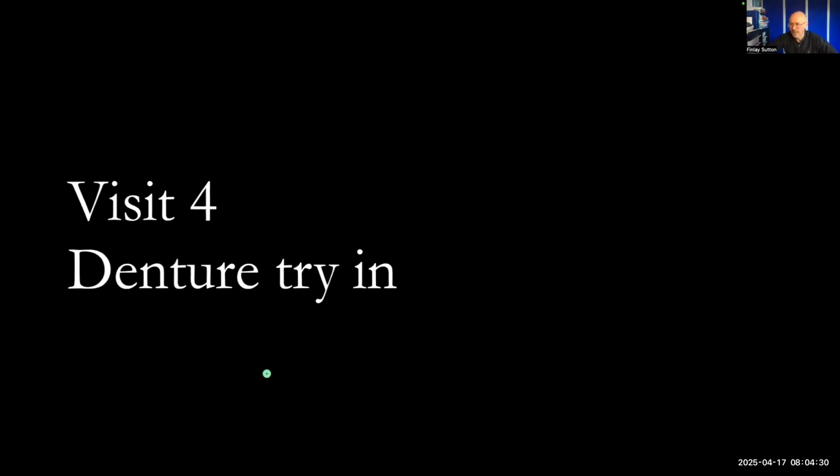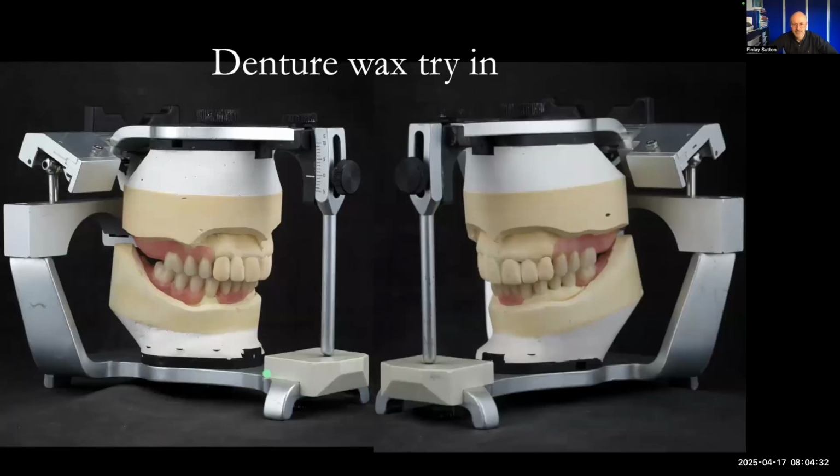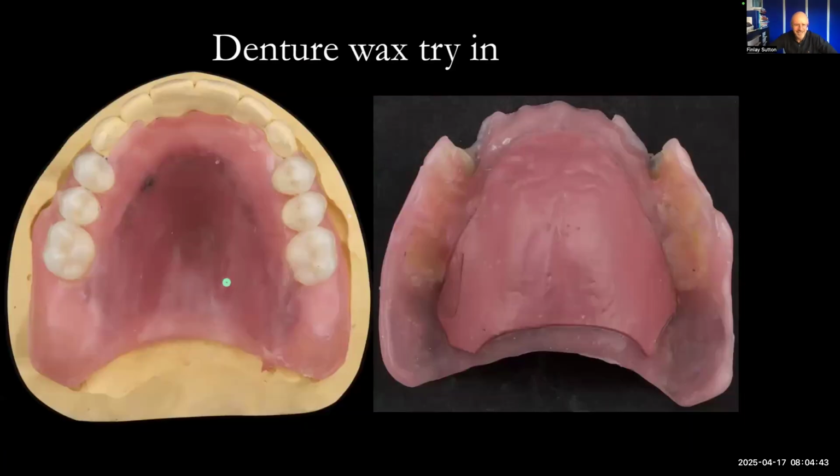So here we have the wax try-in there. So Rowan can mount up the casts and then fix and actually put teeth on. So there we have it. So that's the upper try-in with a shellac reinforcement base. So let's have a look at that.